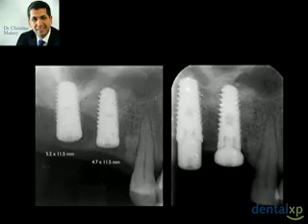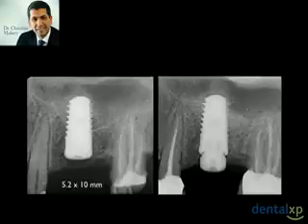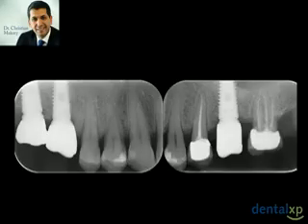If we do a radiographic follow-up of this case 6 months later, we see that the bone is still there and it is starting to get more organized, and it is getting the shape of newly reorganized bone. Also, from the left side, you can see how the bone was organized, and it is getting more and more mineralized, and you can recognize this by the radiographic aspect of this bone. And this is the case completed.